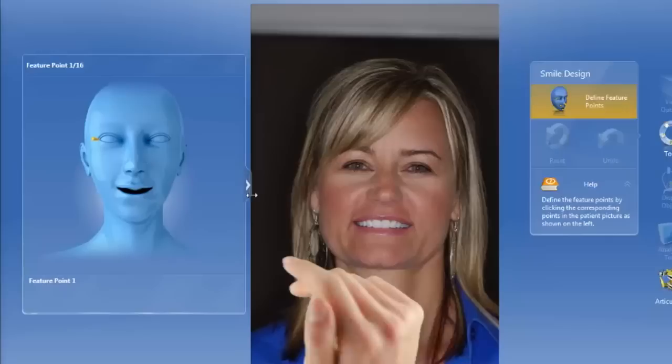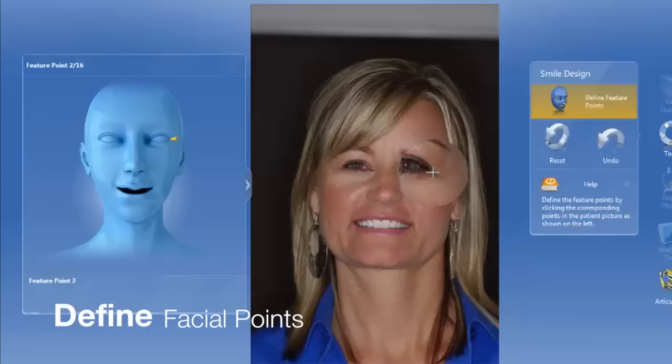We're going to use the new smile design feature to make some prepless veneers for a patient of mine. The first thing we do is take a two-dimensional image of them in a nice smile picture.